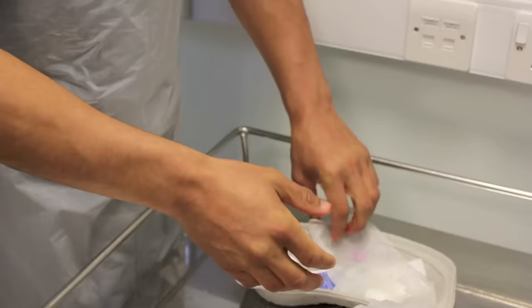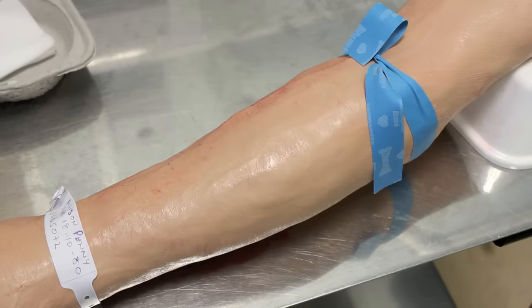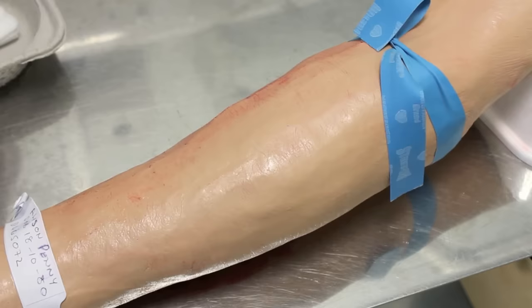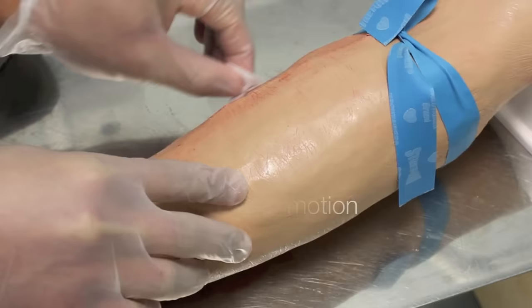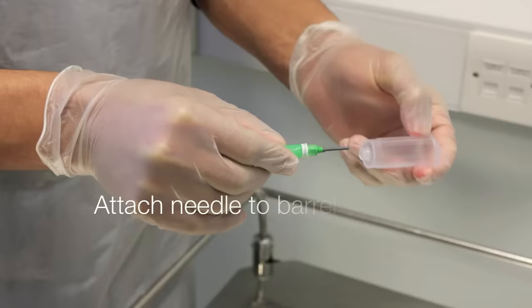Put some non-sterile gloves on. Use an alcohol swab to clean the area that you're going to take the blood from — clean it in a circular motion for about 30 seconds. I'm now going to prepare the needle and screw it into the barrel.